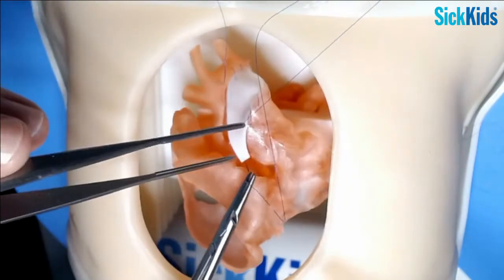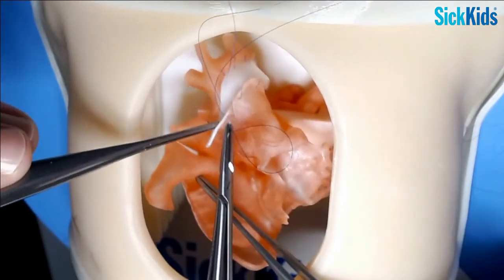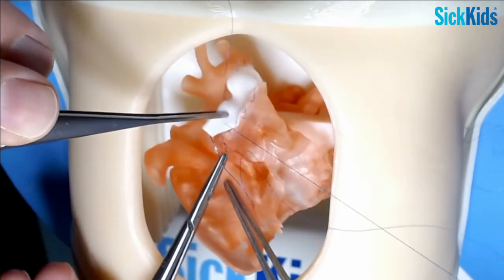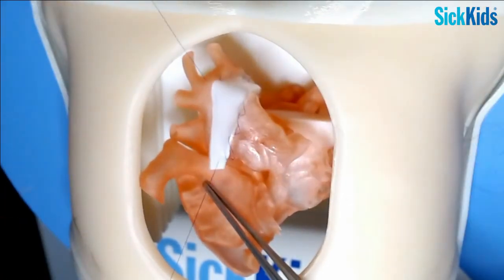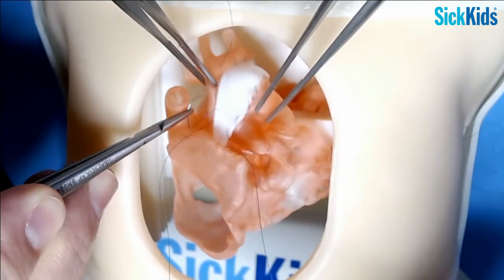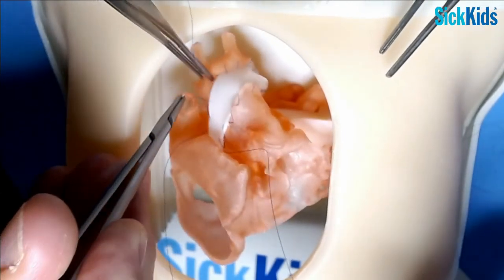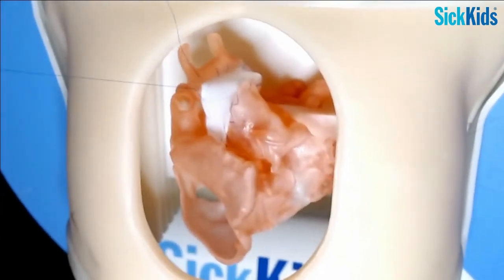So this strategy produces not a long, narrow aorta, but a wider, shorter type of approach. And you can reconstruct these in different ways. But this is the way I kind of like it wider to make sure that it's not going to be obstructive. Oh, this will take 2 or 3 more bites and we're done. Okay, that's your Norwood.